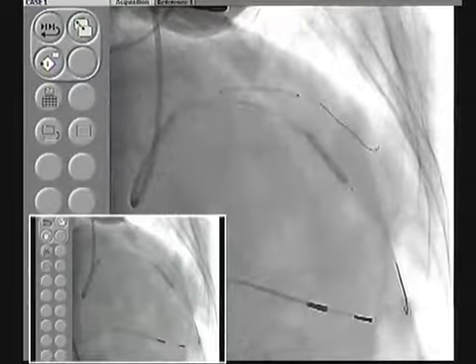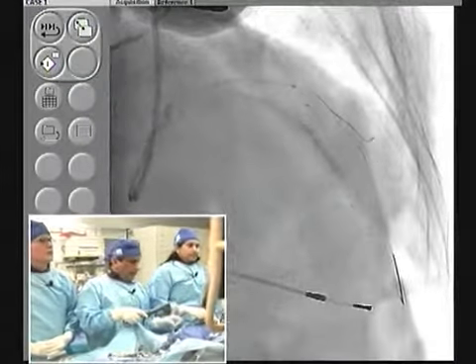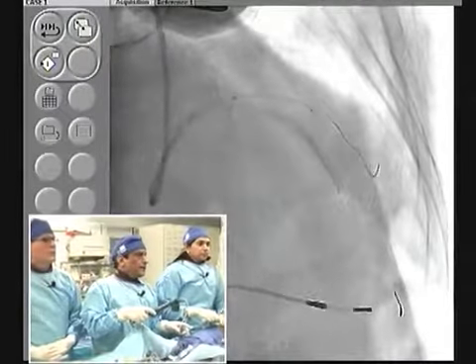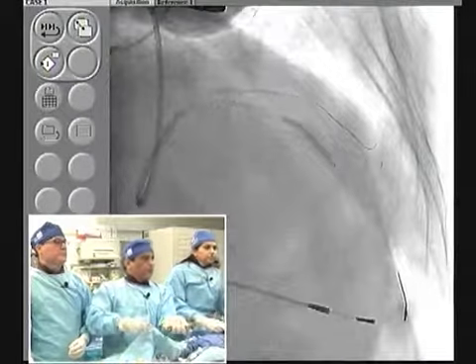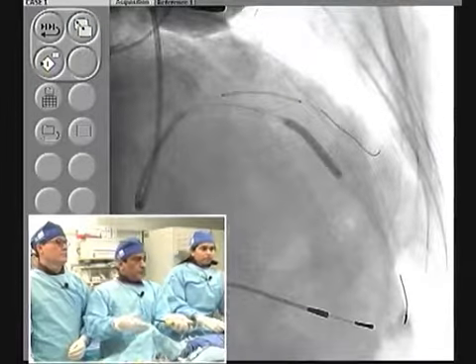In this one, I think because of a lot of vertical displacement, do you want to go 2 millimeter distally? No. Okay, then let's pull back a little bit. If we need to, we can come back a little later for the distal segment. Yeah, good. Here we go 14 to 16 atmosphere, and clearly after rotablation, they should be able to see the thin strut.